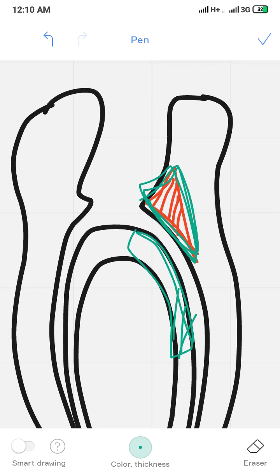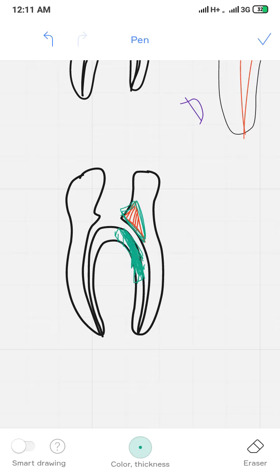If you use that orifice opener carelessly, you will end up losing tooth structure from this side and eventually weakening the tooth. More aggressive use might actually open, it's called stripping, strip the coronal area. So you have to be very careful.